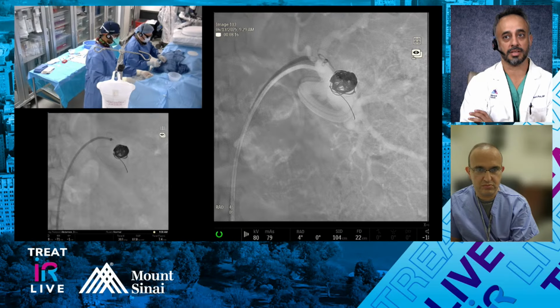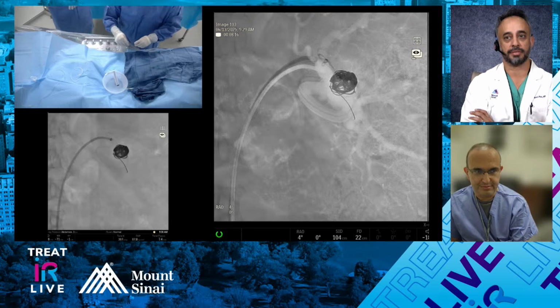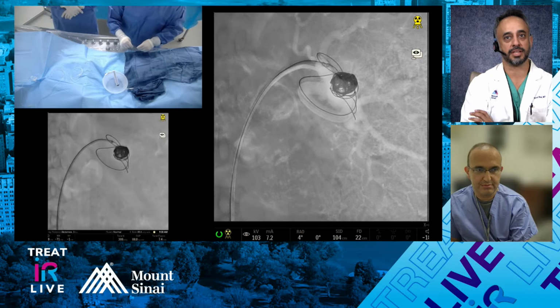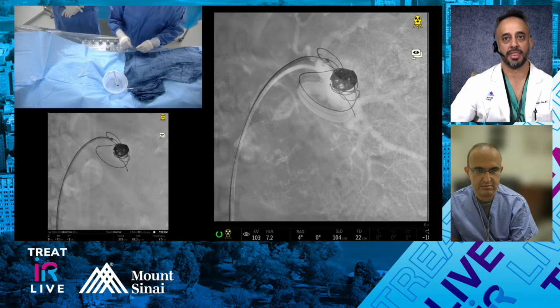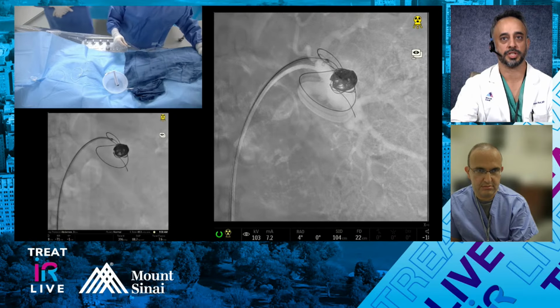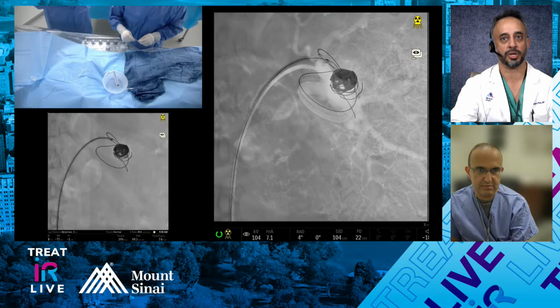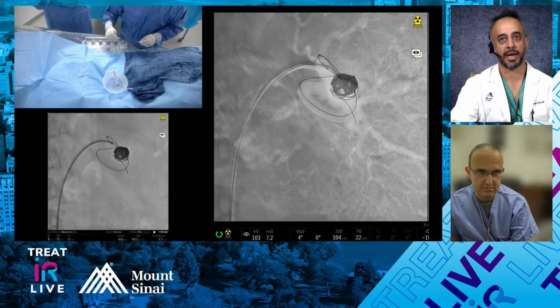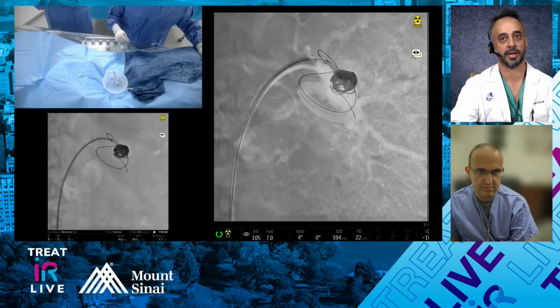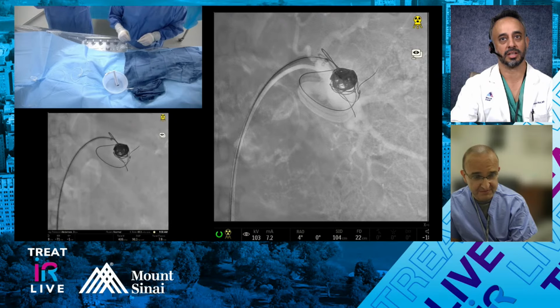Same, yeah. I sort of do the Russian nesting doll kind of thing, where it's a big frame and then slowly start to downsize. If I feel like I have enough pack, or enough metal in there, I'll switch to the packing coils, the even smaller, unshaped coils. Here, obviously a packing coil will just leak out the back, so you don't have enough frame to switch to packing coils quite yet. Yeah, just like Rahul said too. And I like the fact that your fellow picked a 50 centimeter coil.